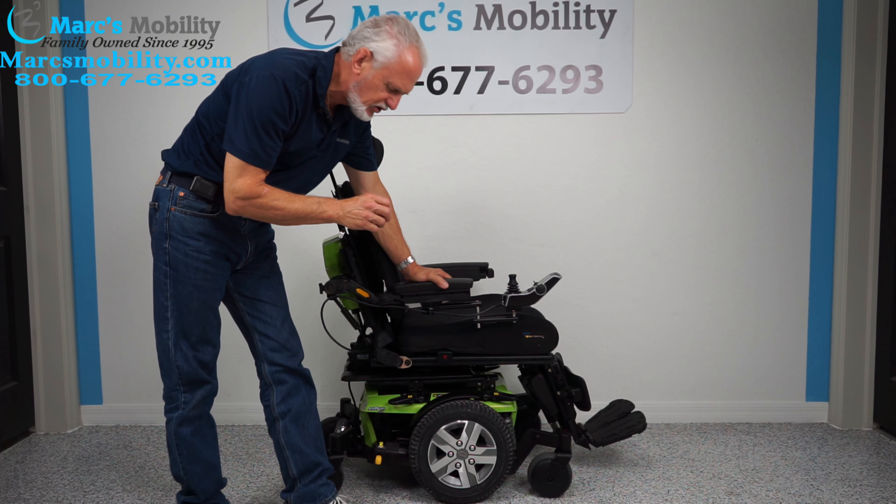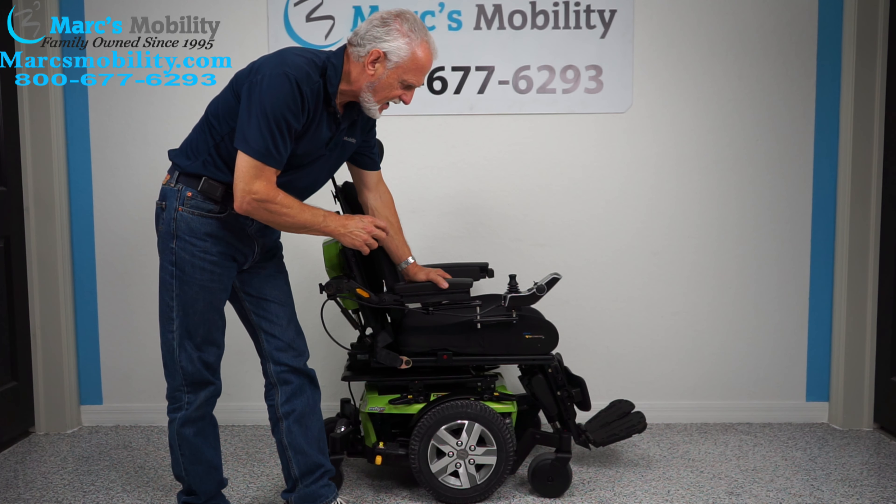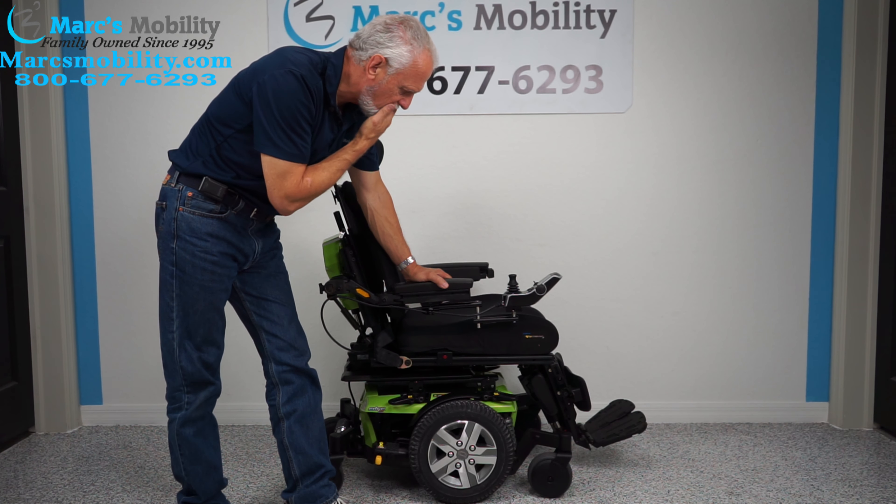Hi, we have here a Quantum Edge 2.0 Neon Green, beautiful color. This chair has one mile, so it was delivered, never used.